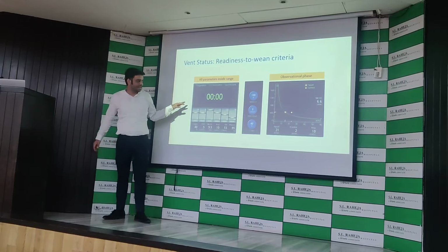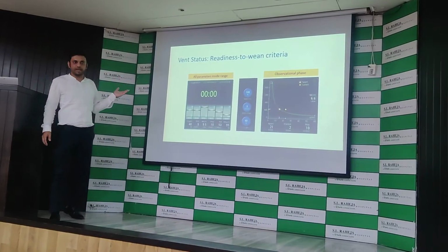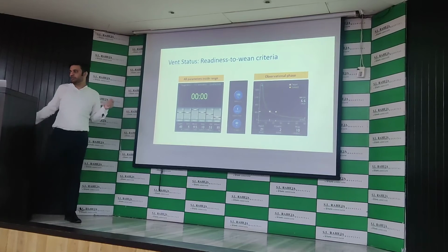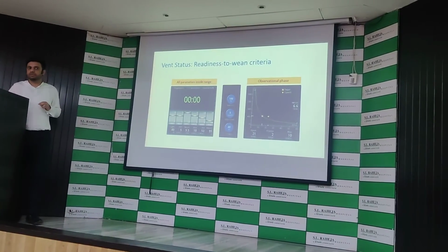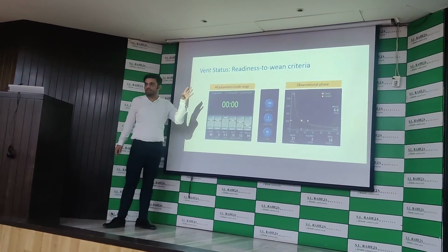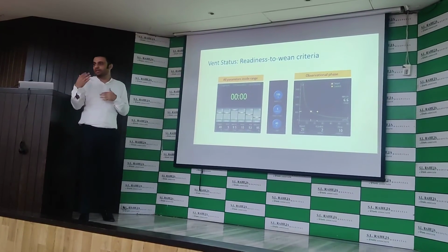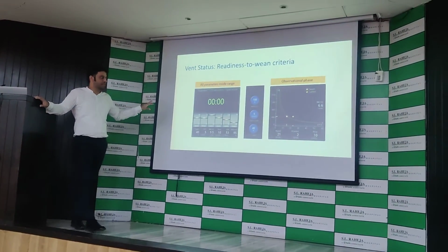So exactly when it comes to this, it starts the SBT automatically, and then it will run for around 30 minutes. After that, it can give a status message to consider extubation. But looking at other criteria, of course, such as tube obstruction, secretions, fever, and other things, you will anyway have to see, even if it is in this state.